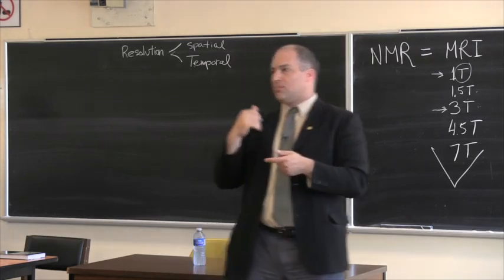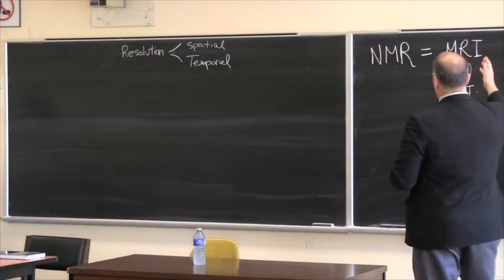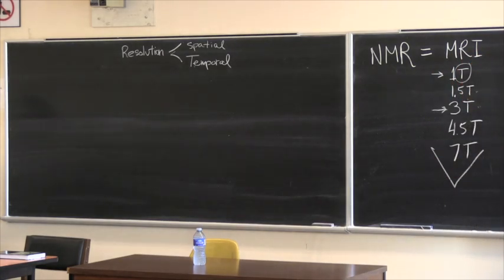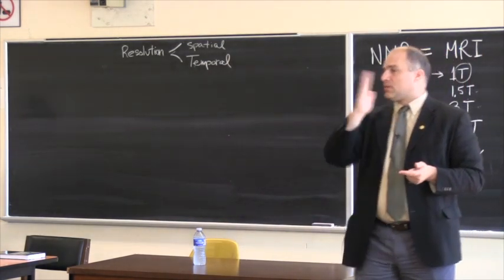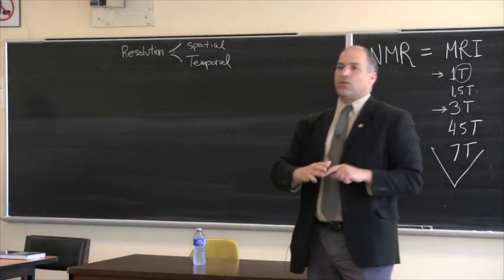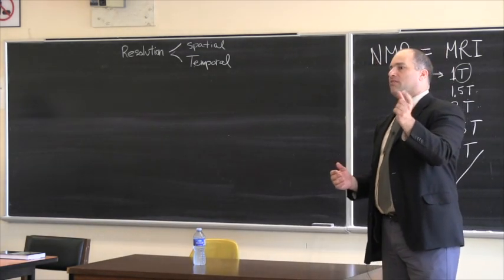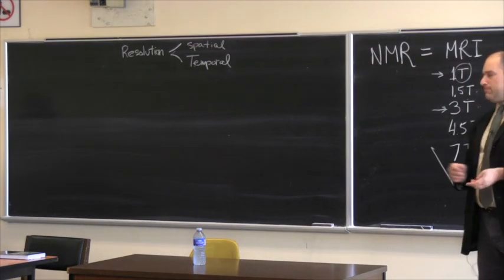The time that it takes them creates a picture, and that picture is the MRI, or variations on that particular technique create the MRI picture. Then we get different times or different alignments for different structures: for white matter versus gray matter, for things that are rich in myelin and fat versus things that are not, things that are rich in water, things that are not, and so on.